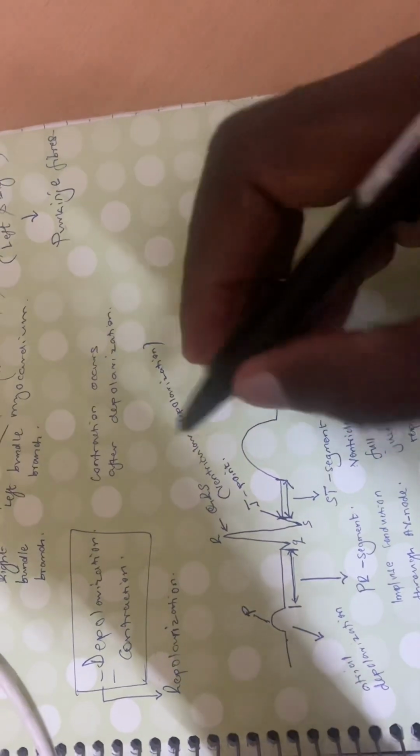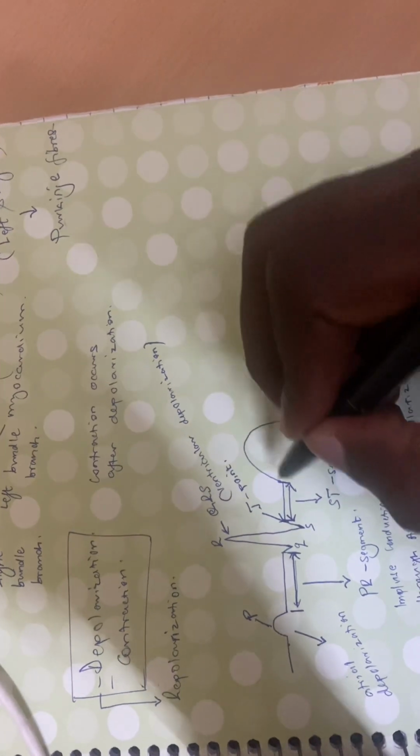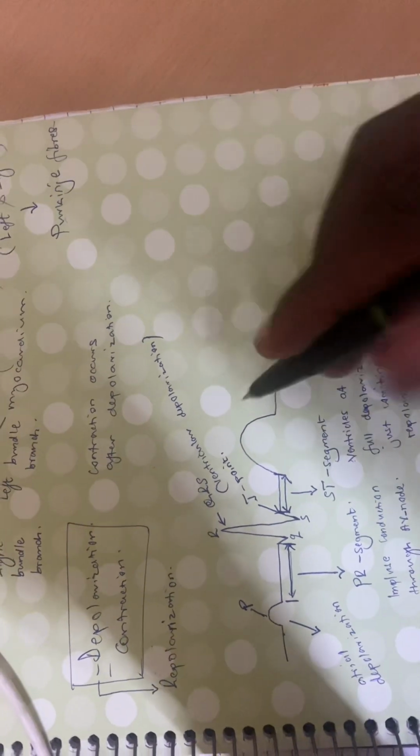Just waiting to repolarize. Ventricles at full depolarization, just waiting to repolarize. That segment is represented as ST segment. So ST, end of S, and then beginning of T.